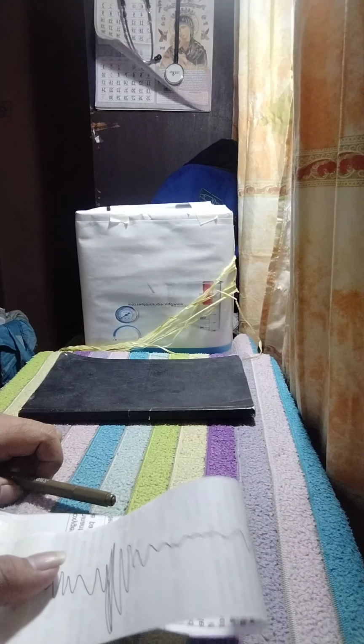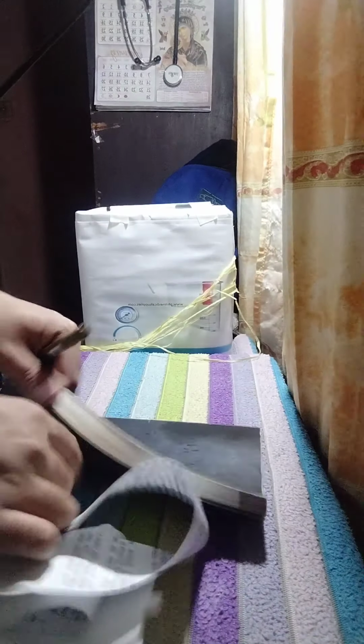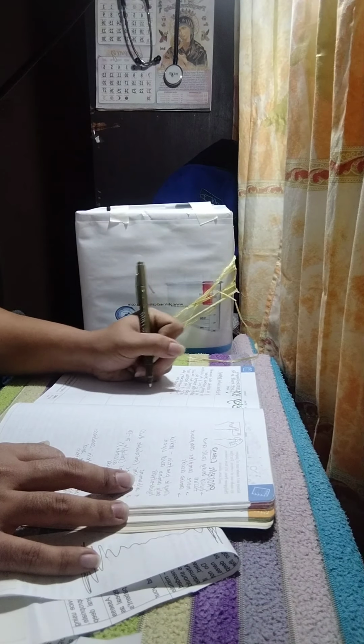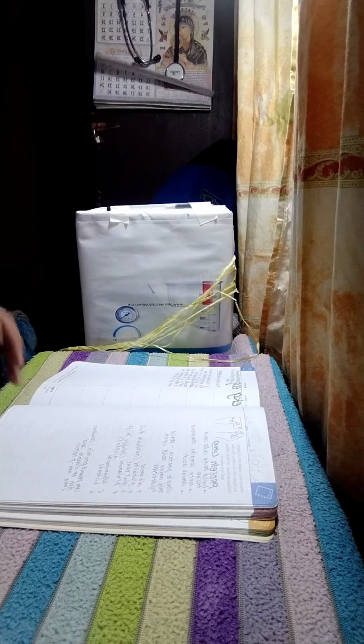Next, for evaluation, note the quality of the ECG obtained. For documentation, secure the ECG strip to the chart. Document the patient's name and the date and time the ECG is obtained.